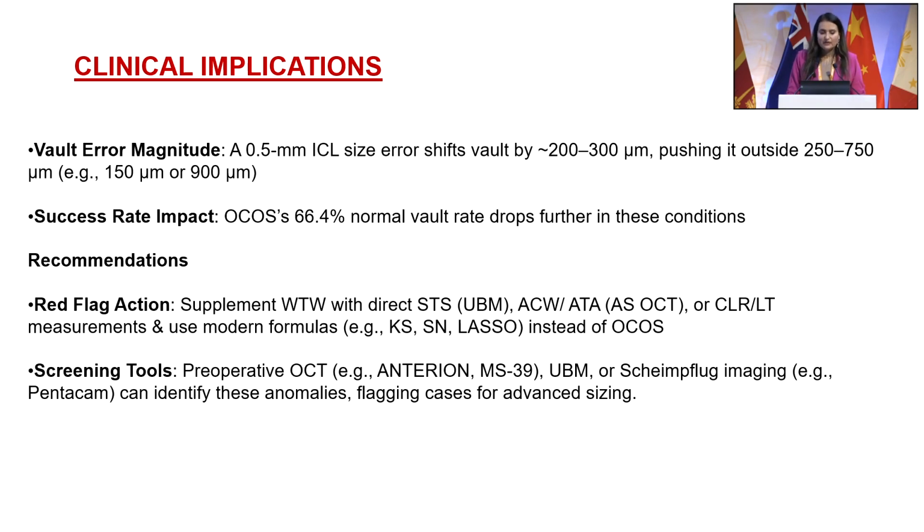So what is recommended is that in these eyes, it's better to supplement the white to white with the direct STS, which you can of course measure with the UBM, or the angle to angle, which is measured using the OCT, and CLR and some of these newer biometric methods, and using the modern formulae. Also use better tools for screening, such as the preoperative OCT like Anterion, MS39, UBM, or Scheimpflug imaging, to identify these eyes with red flags for proper sizing.